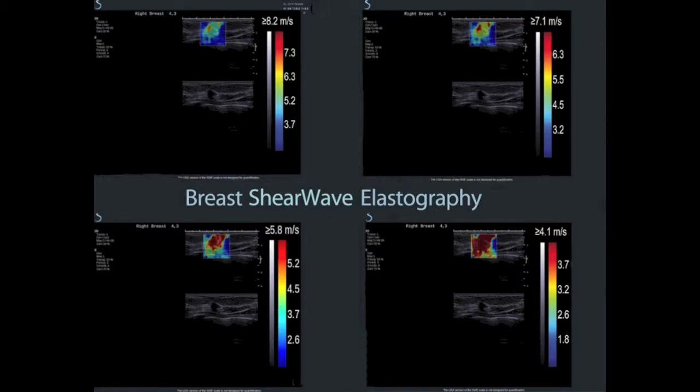And of course, this scale will be different per organ, per lesion in a given organ. If you look at the breast, for instance, and you want to look at lymph nodes instead of lesions, you may want to use a lower dynamic range. So that's very similar to a dynamic range adjustment in other areas in ordinary imaging. That is exactly the same adjustable dynamic range like in every other imaging modality.